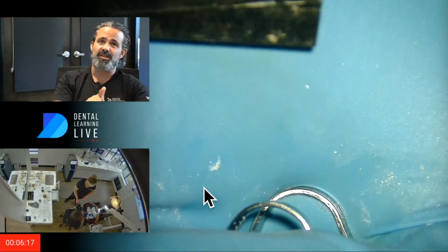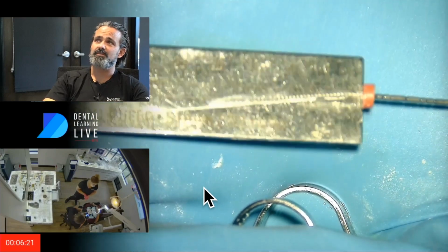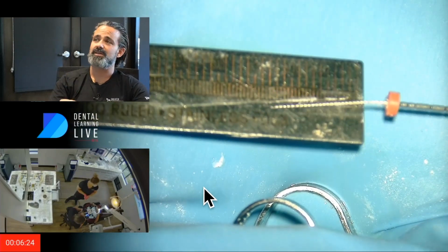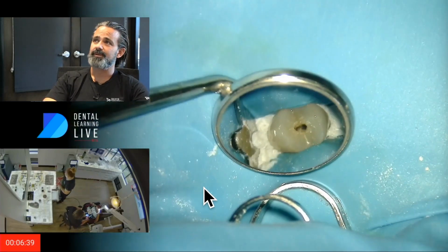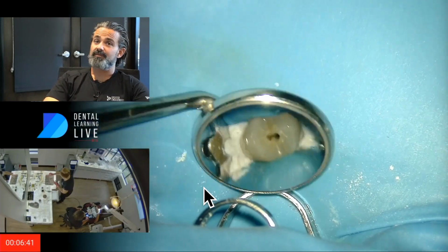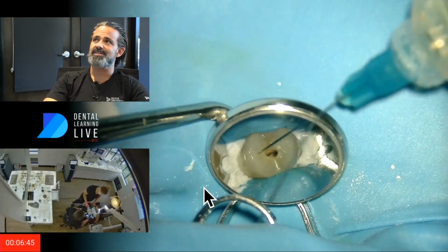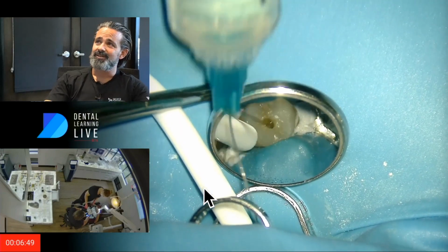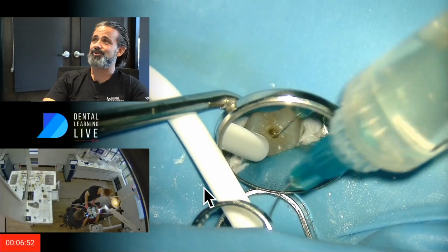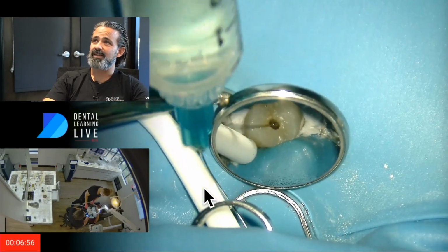So I'm considering that there's a delta here or some sort of apical fast break, simply because it's just not reading correctly, and you saw that little thing that came out here. Taking a length, very short. I think there's a tendency that we all always go to 18 because for the most part we can. Sometimes you can't when they're shorter than that. This is one of those times. A little bit of hand irrigation.